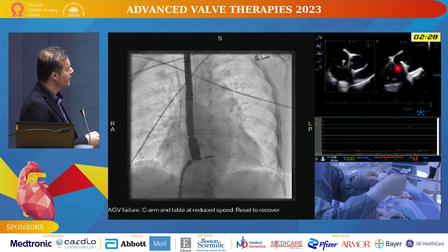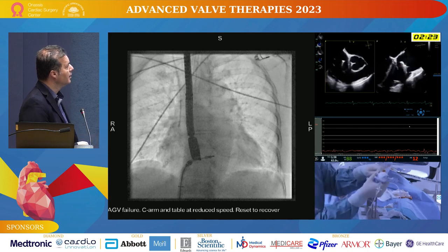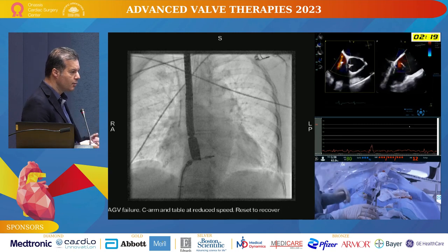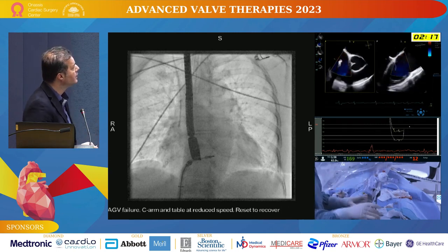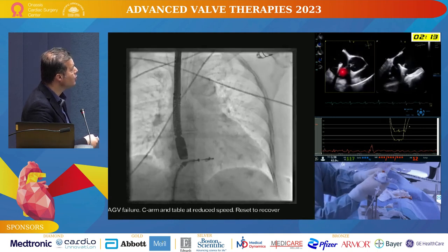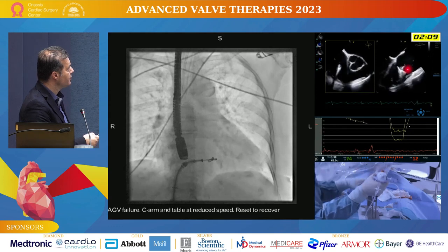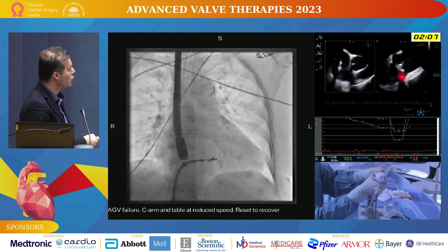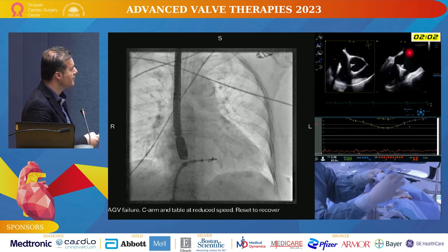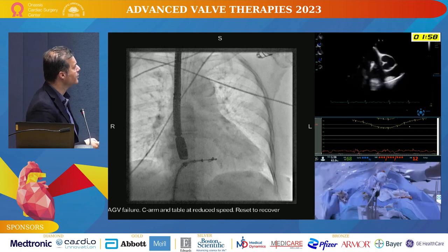Here we have opened the arms already, and we have checked the independent grasping. We can see, for example, here that it is the anterior part of the clip that moves. We see that our clip is above the coaptation zone here, and we just push the clip above the leaflets, almost touching the leaflets. We don't want to cross the leaflets. So here is the independent grasping. It was the septal leaflet, actually, not the anterior.